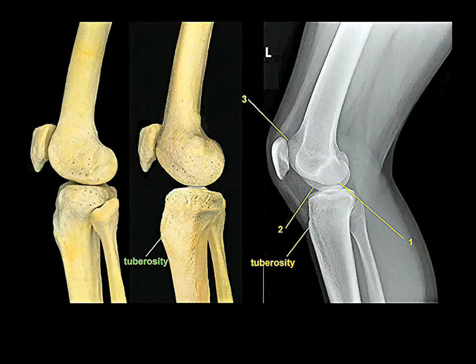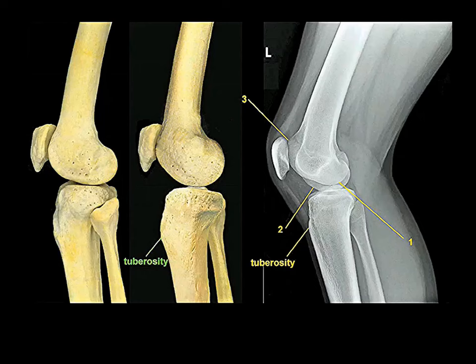This is a lateral view and this is a medial view of the knee. You can tell it's the lateral view because you can see the fibula — the fibula is on the lateral side and articulates with the lateral tibial condyle.